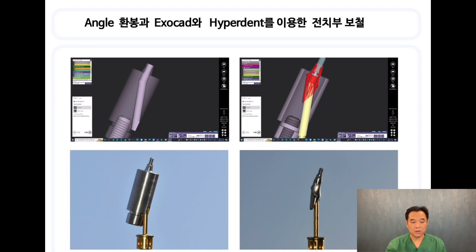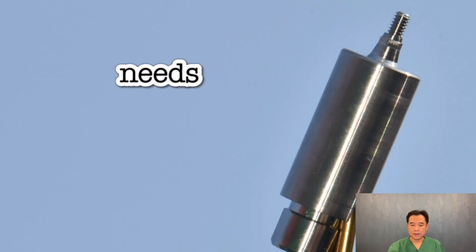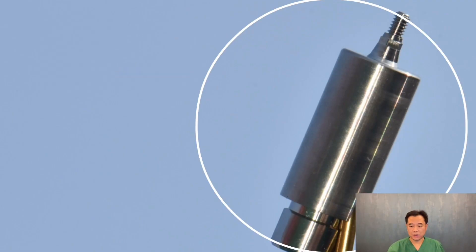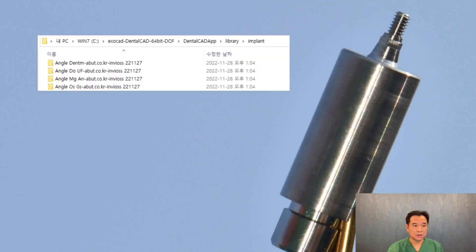We need three things. First, the angled custom abutment. Second, an implant library for the angled custom abutment. We can provide this implant library in a zip file, and you can simply save it under the implant file. Then you need to restart Exocad in order to use the library to start designing.